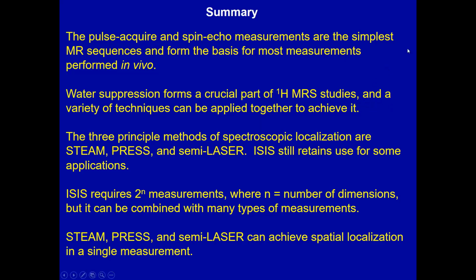Notice this specifies proton MRS studies. If we were doing nitrogen, carbon-13, phosphorus, those don't have any hydrogen in them. I mean, there could be hydrogen in the molecules, but there's no way that we can detect hydrogen when we're in the frequency band looking at phosphorus. So water doesn't interfere with our signal. For proton spectroscopy, the water is very, very present.